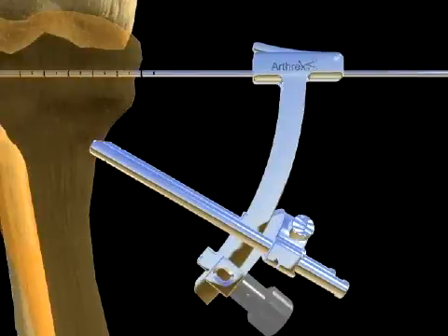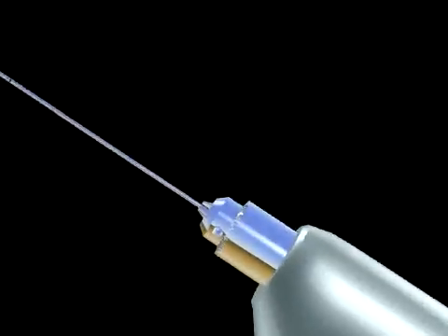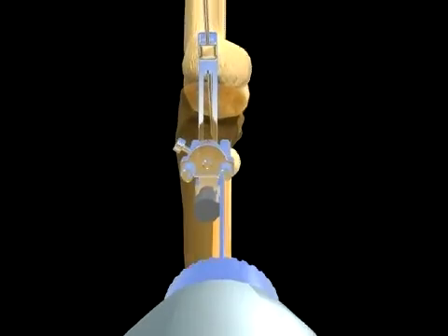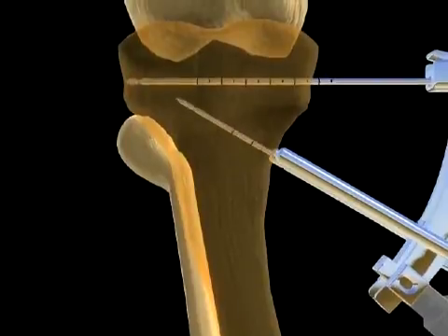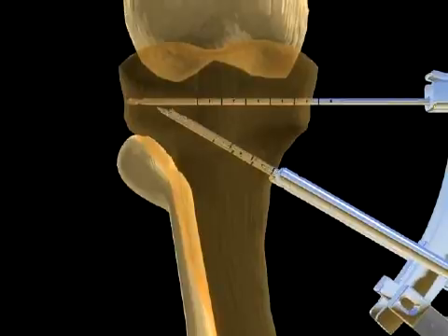The two 2.4 mm breakaway pins are drilled to a depth that intersects the plane of the 3 mm guide pin when viewed in the AP plane with fluoroscopy. The osteotomy is created along the plane established by these pins, and a 1 cm lateral cortical bone hinge is made when osteotomes are driven to the same depth as the pins.